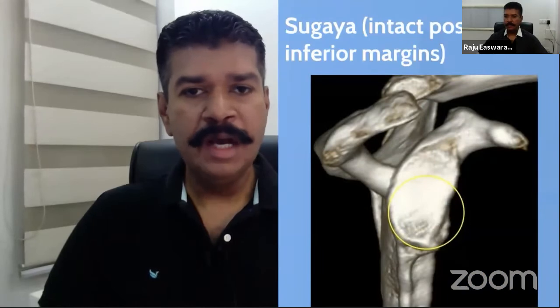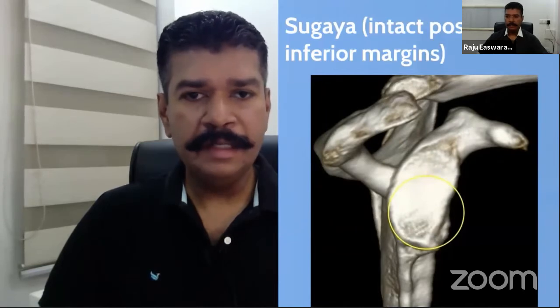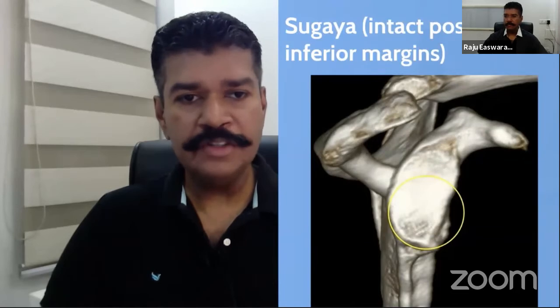And once you are able to get a good en-face view of the glenoid, you draw this circle and you can calculate the area of the glenoid bone defect. This can be done directly by a radiologist, or as I will tell you later in the presentation, you can use free proprietary software like ImageJ on how to do it.